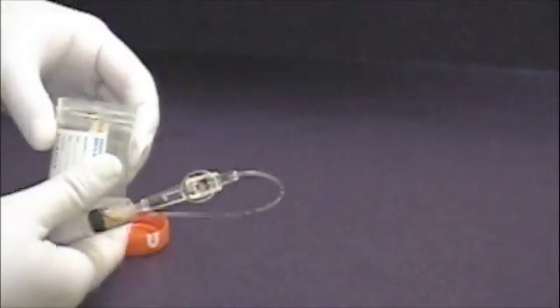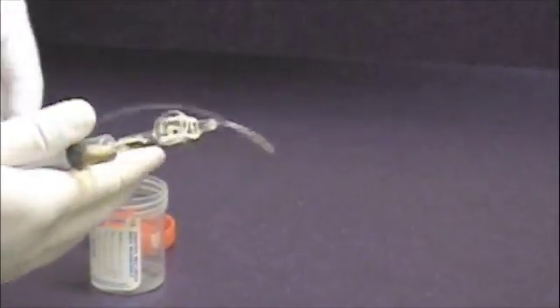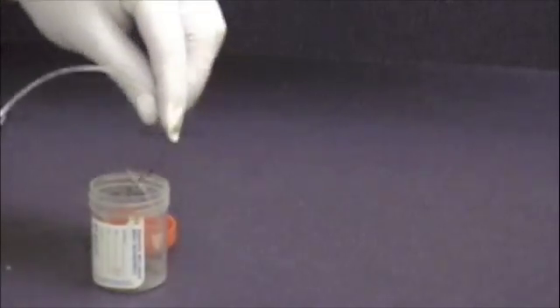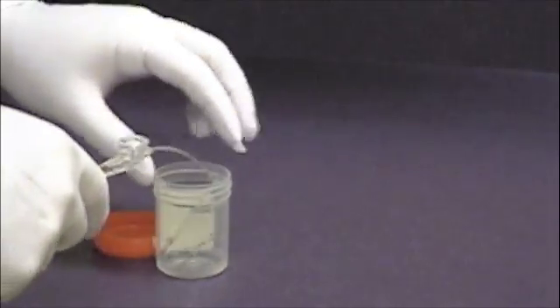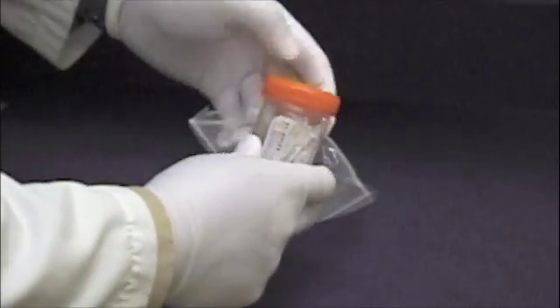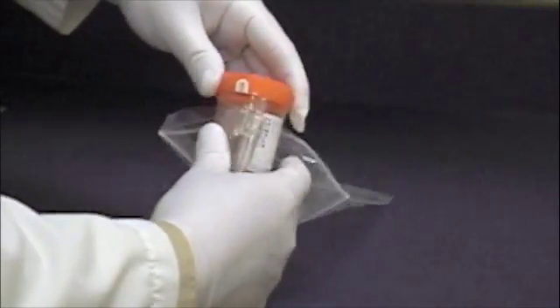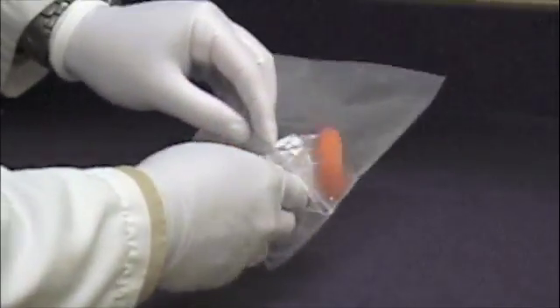When specimen transport is not required — for example, for collections done at the same site as the testing lab — flushing may be omitted and the tubing can be placed directly into the transport container. Ensure the lid is tightly sealed and prepare the sample for immediate transportation to the lab, ensuring all documentation is present.